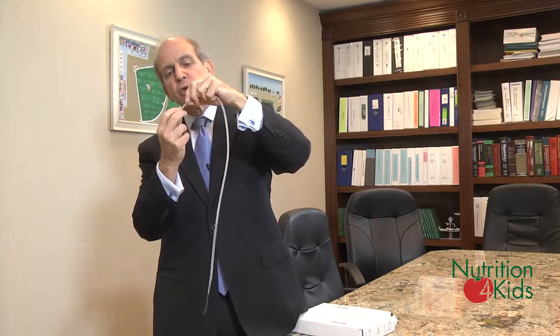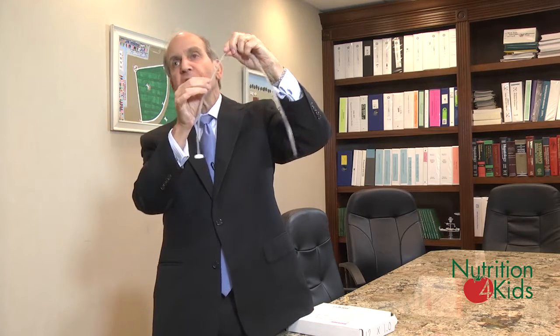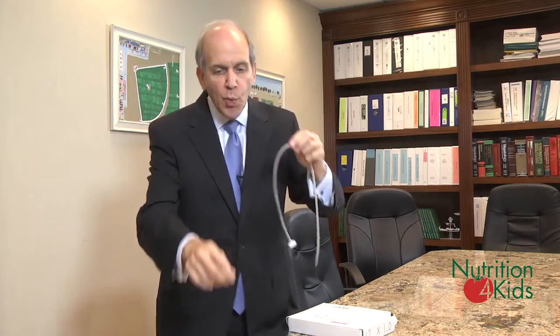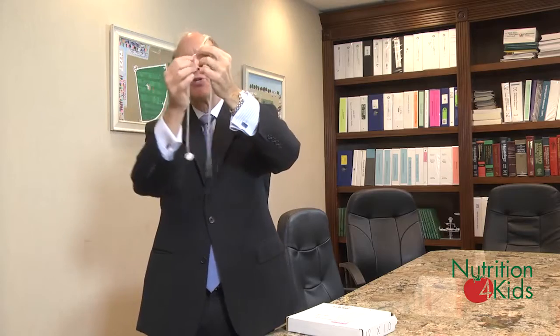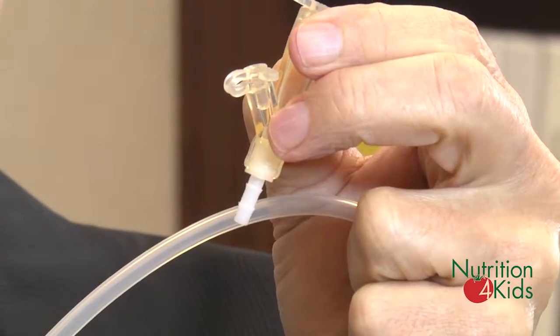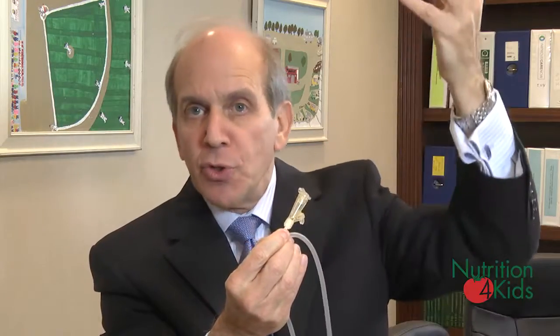The idea of that is that we have to get something to anchor it inside first. Once that's done, this tube is then brought through and cut to the desired length. It's then attached to a tube that goes into it, allowing for the delivery of nutrients, so that all of the nutrients that are either in a bag or in a syringe can be inserted into the tube and into the child's stomach.